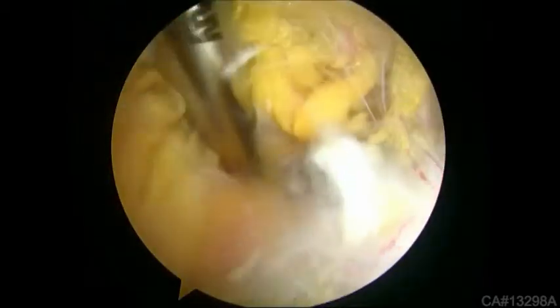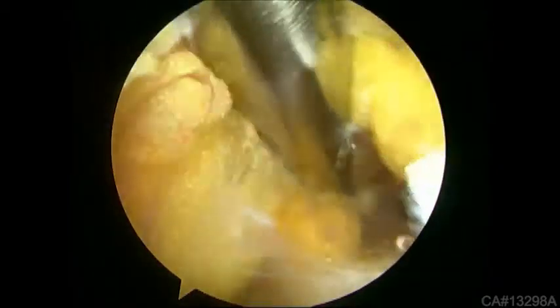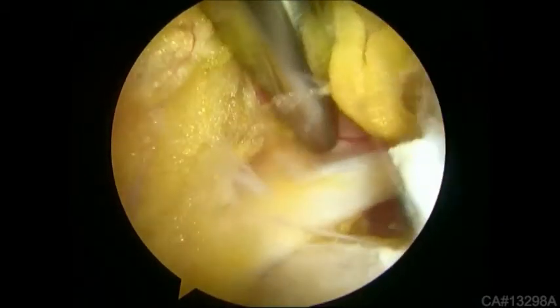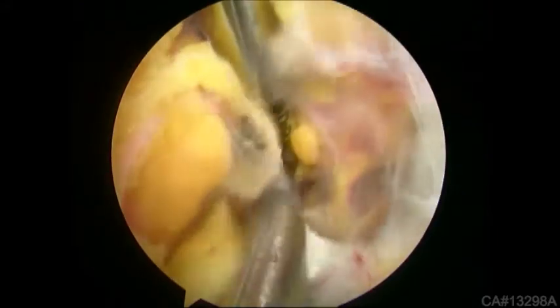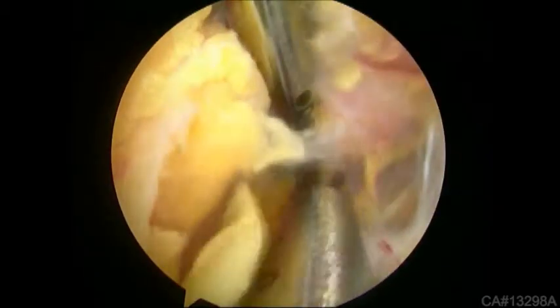If bleeding is encountered, a bipolar cautery is introduced through the anterior portal to control it while retracting the neurovascular structures medially. A motorized curved shaver is used to remove the stump of the remaining ligament to prevent excess scar tissue.